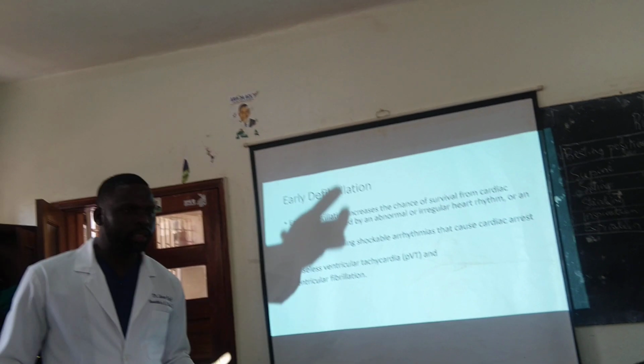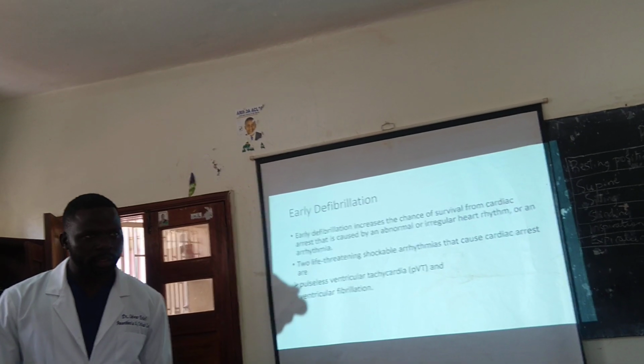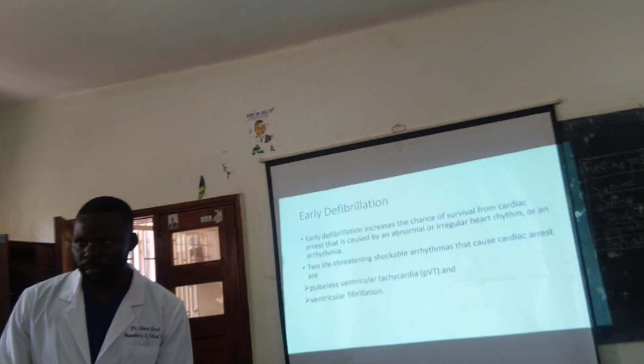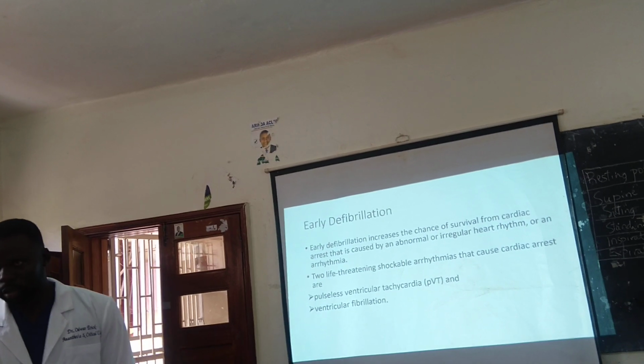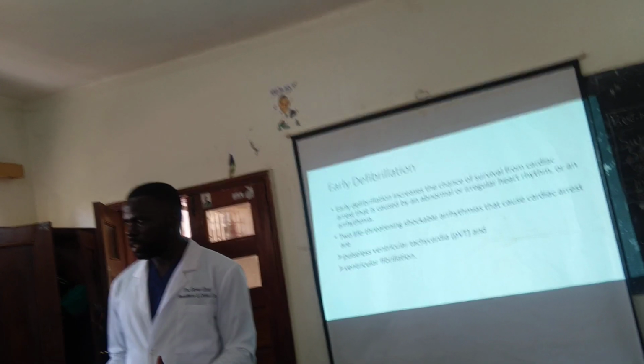Then after maybe 10 minutes, the defibrillator arrives. You connect it to the patient. The first thing you notice is a shockable rhythm. Then you start preparing for the shock. Now that is going to be late what? Defibrillation.